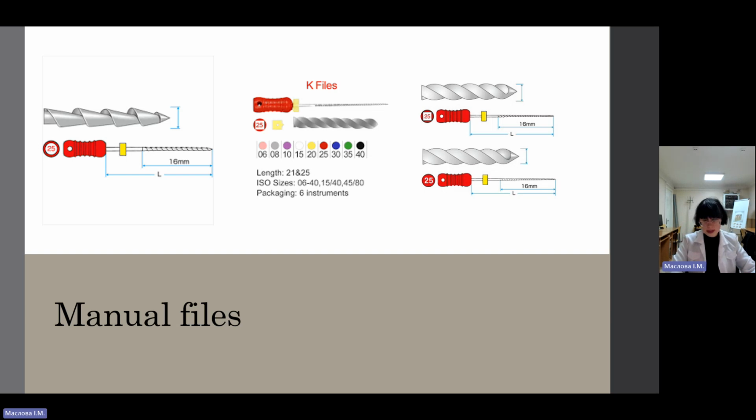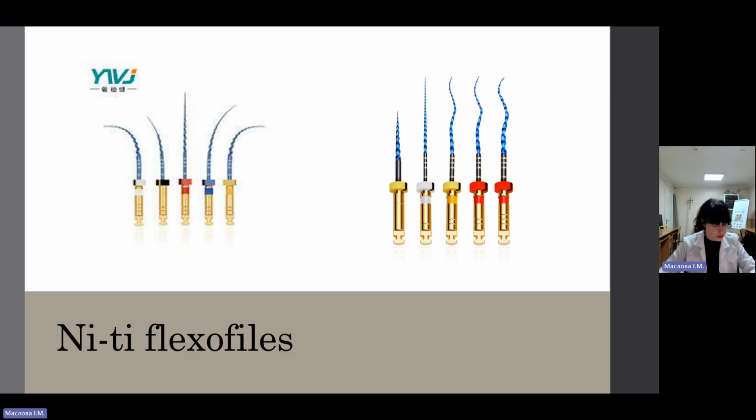What about NiTi instruments, or nickel titanium instruments? There have been a number of developments in instrument design and technology. Instead of stainless steel, nickel titanium alloys have been introduced in the manufacture of endodontic instruments, and NiTi files are widespread in endodontics.